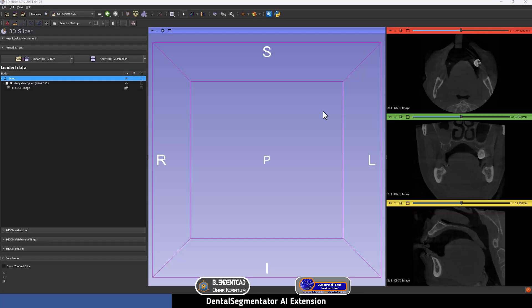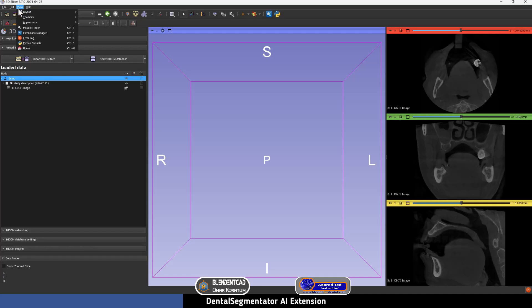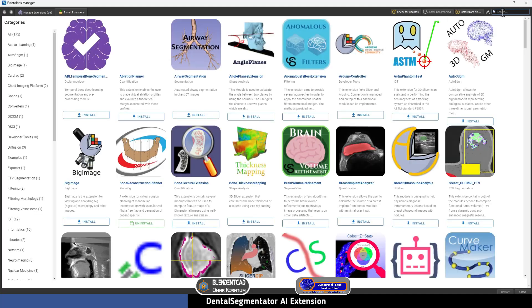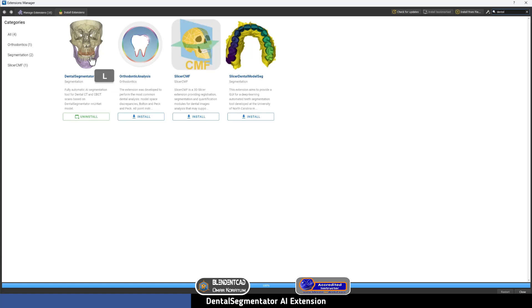Now that 3D Slicer has opened the DICOM file, you will see the slices here and the 3D view. In this video I'm going to segment the DICOM file using Dental Segmentator AI. In order to install it, you can go to View, Extension Manager, Install Extensions, and then type in the search: Dental. Here is the extension — you are going to press Install and then restart the program.